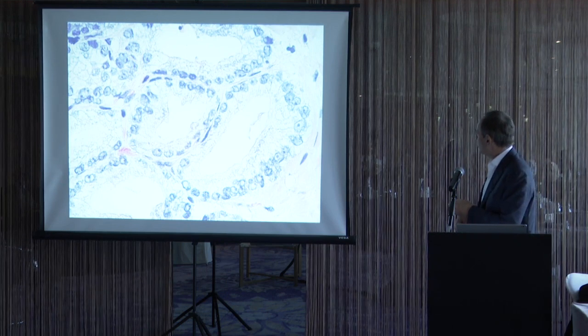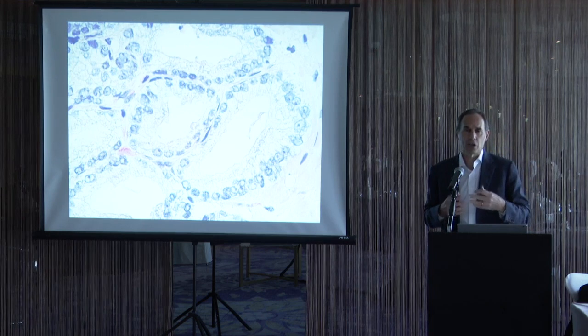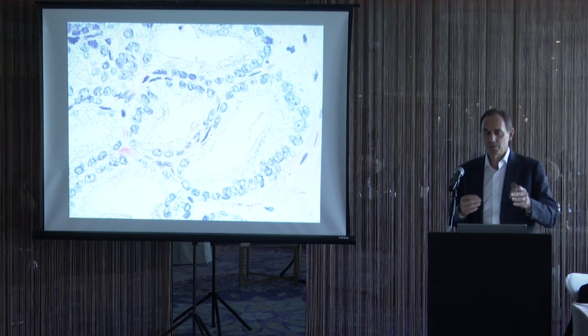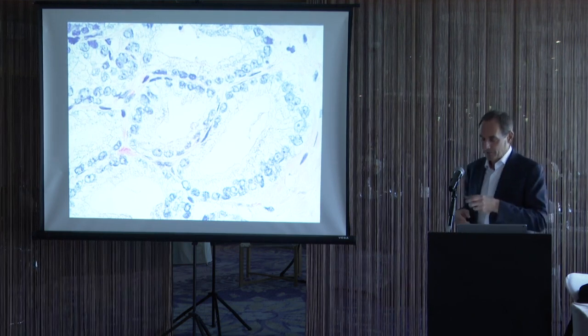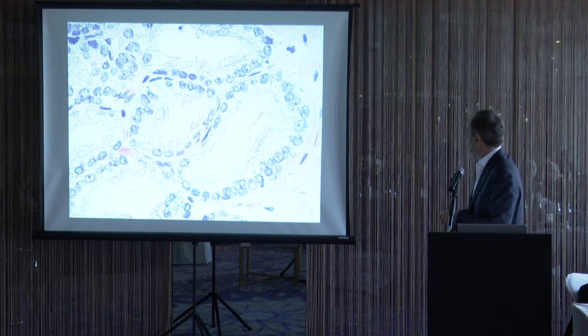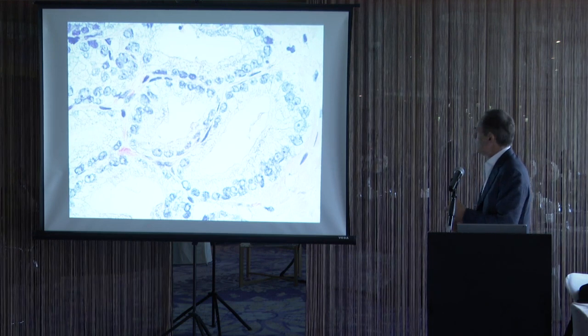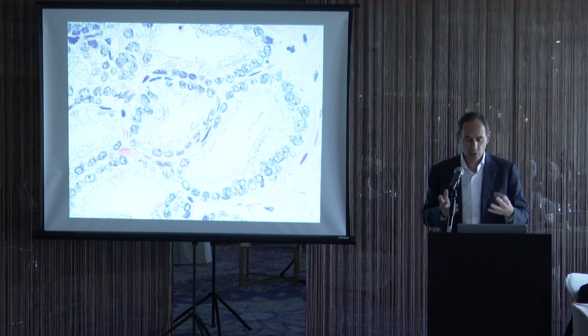The other issue that this slide highlights is the problem of looking for basal cells on the routine H&E section. It can be very difficult, almost impossible, to tell what's a basal cell on the H&E as opposed to a fibroblast. So this is cancer, but for example, this cell would be indistinguishable from a basal cell. These are just fibroblasts, but again, on H&E, without special stains, for the most part, I don't look for basal cells.